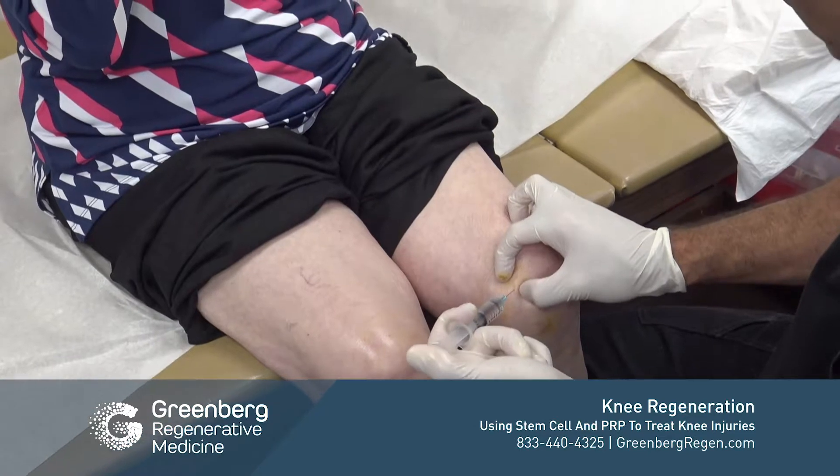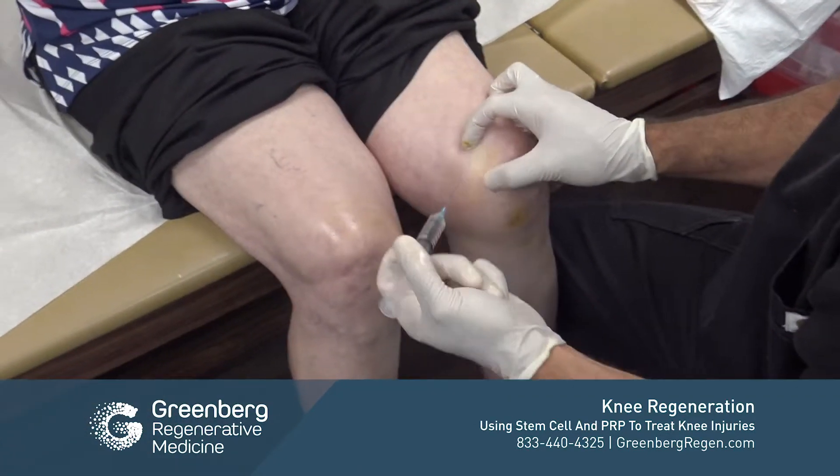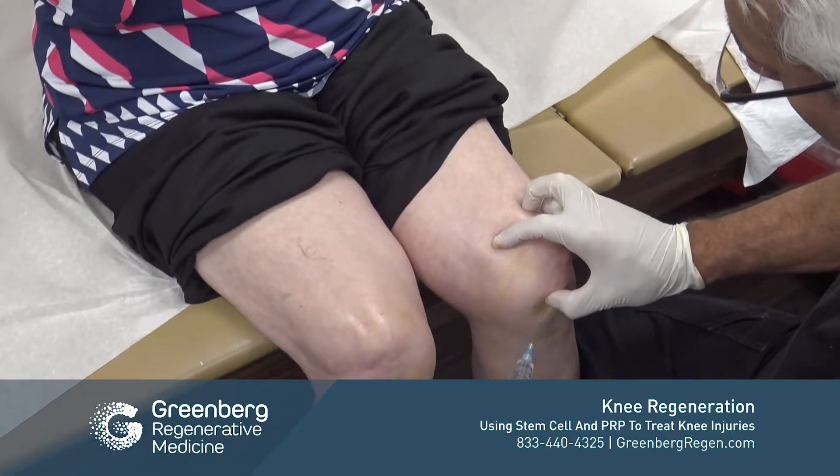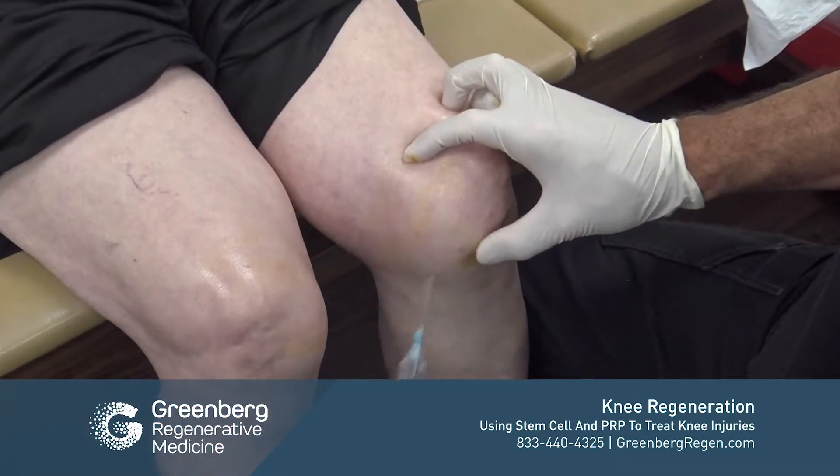We're also going to perform a field block for the patient as well, which means giving some local anesthesia along the skin to help further numb the field.